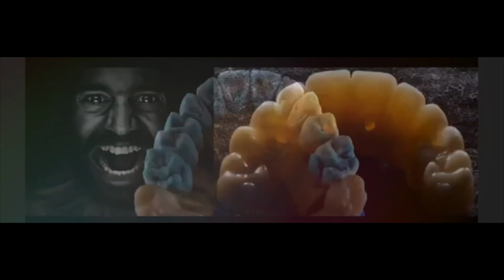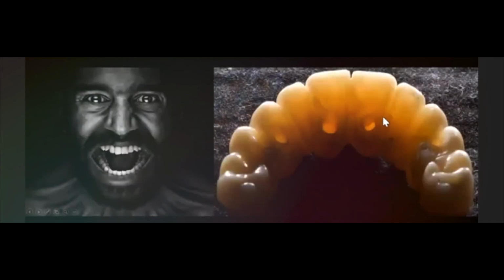And as you can see in this case, we got some cracks, and we didn't deliver this case. We didn't place the case in the mouth. So it was a laboratory mistake. The bake schedule was wrong. So it was a lot of stresses that finally made some cracks, and all these cracks, as you can see, finally go where the holes are, because the holes are the weak areas.